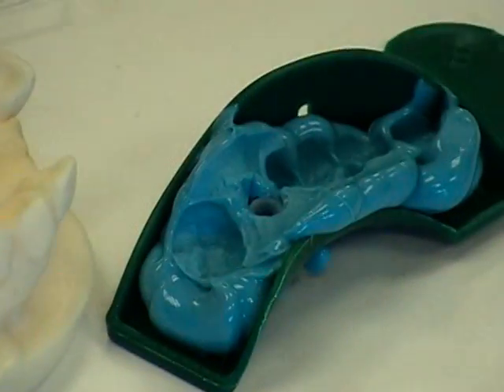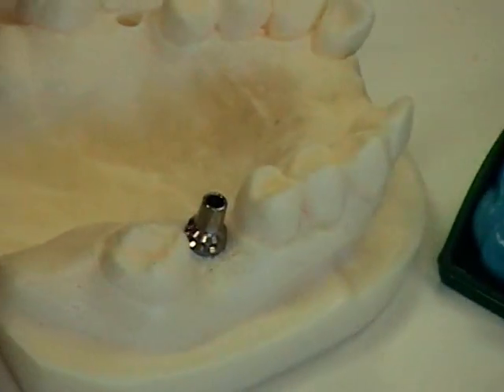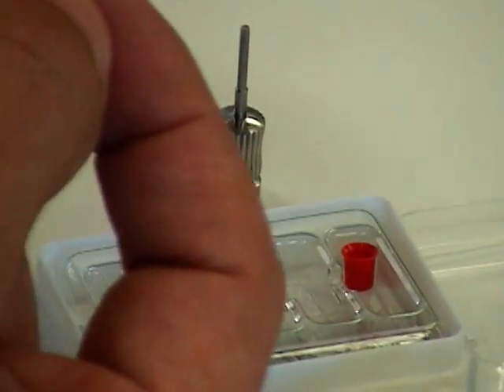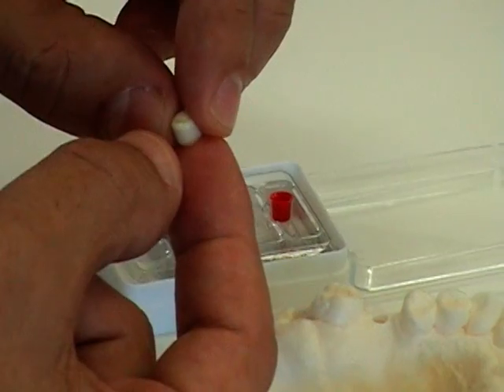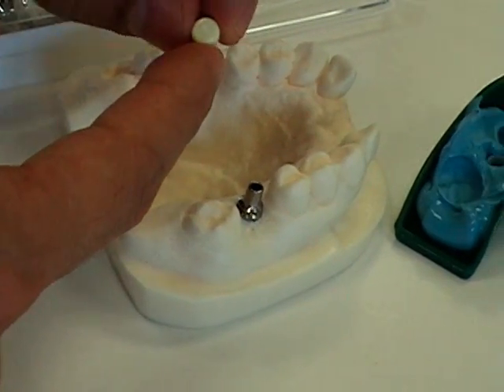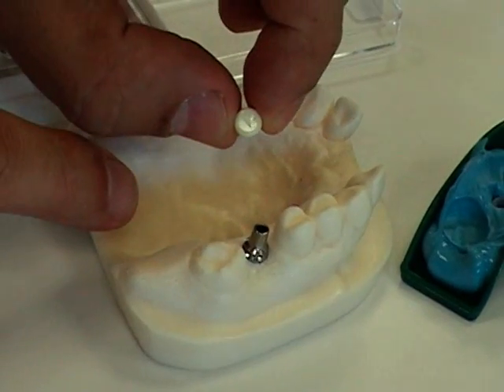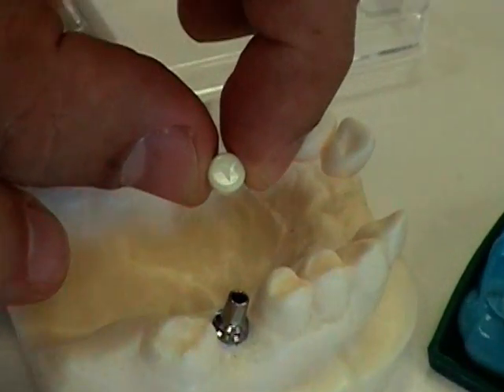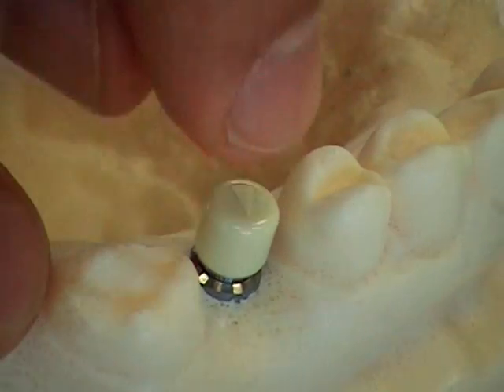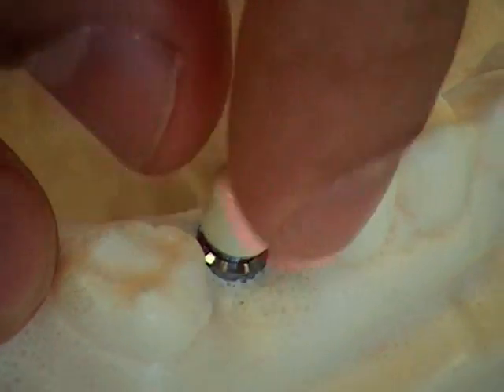We'll now put on the comfort cap. It is recommended to use a little bit of temporary cement to keep it in place, but in this case, we'll just show that it fits down. Again, there is a flat side on the inside which corresponds to the flat side on the abutment. So when they line up, the plastic will drop all the way into place. There is also an arrow on the top which indicates the flat side.